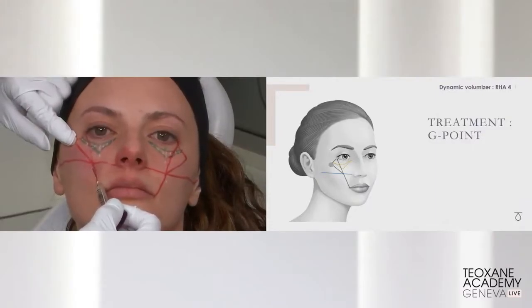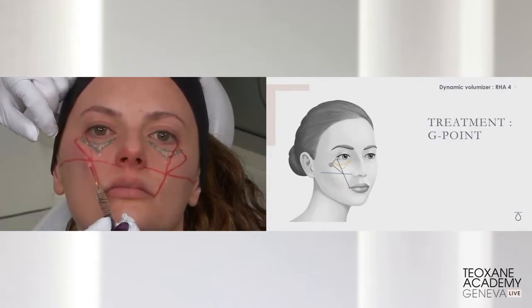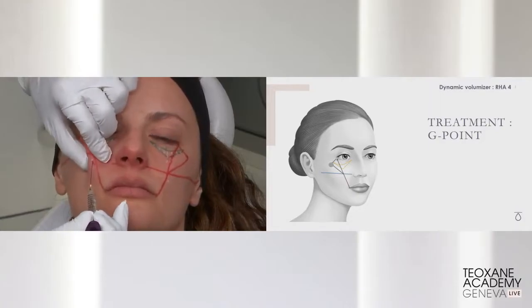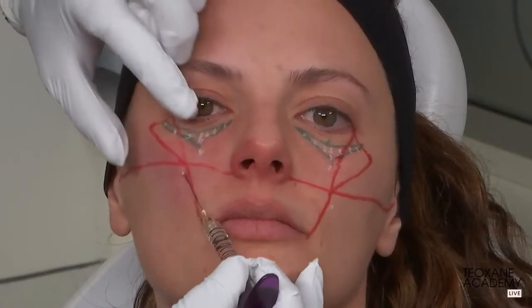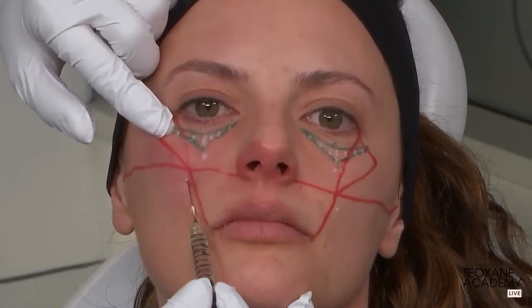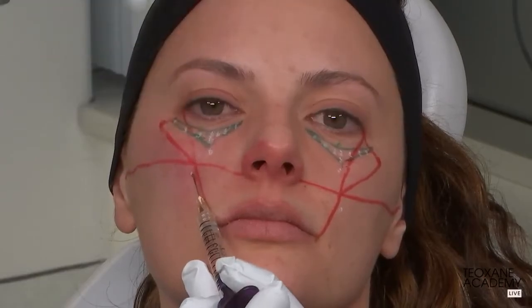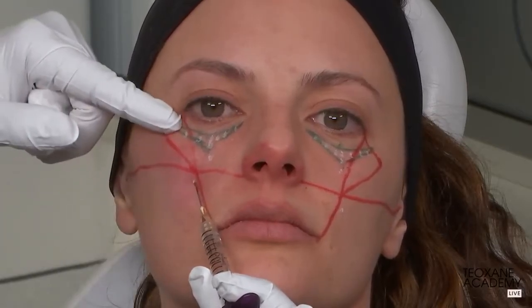I'm injecting with RHA4, which I find extremely indicated for this treatment because it has enough G prime, and at the same time has enough stretch to be used in a very dynamic area such as the infraorbital area with the orbicularis muscle. So again, I slide superficial, then I pass and go above the orbital rim. Here, I always find the resistance of the orbital retaining ligament, and I want to pass that resistance with my cannula. It's very easy to do so laterally. Here, I will deliver half of a bolus at this lateral point.